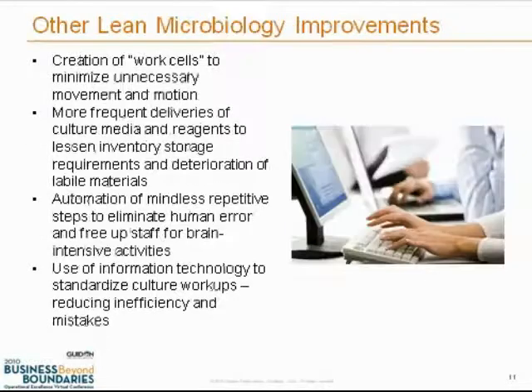Now on the next slide, I've mentioned some other lean microbiology improvements that we are realizing in our laboratory. One of the recommendations from Guidon, as I mentioned before, was to reorganize the laboratory so that it was more efficiently arranged so that the staff would not have to get up and walk around any more than is necessary. And we have done that by the creation of what are called work cells, that minimize unnecessary movement and motion.